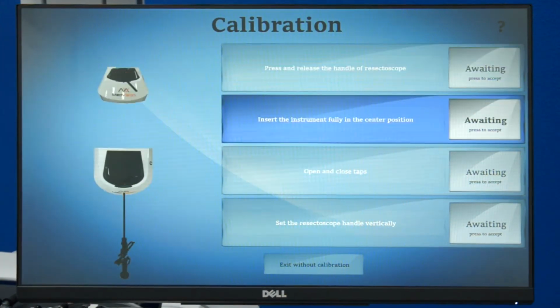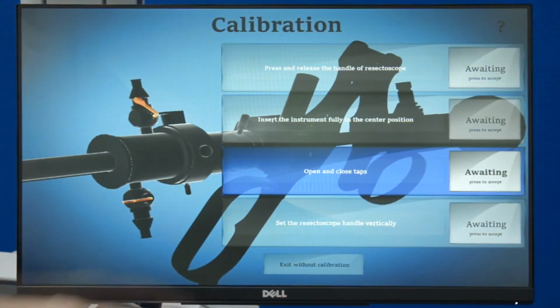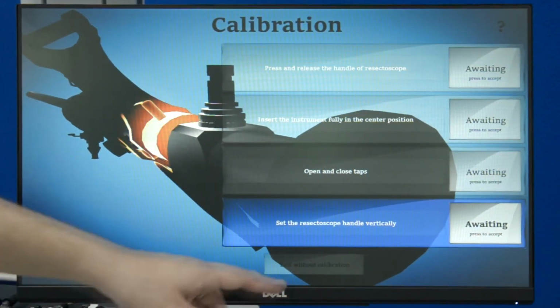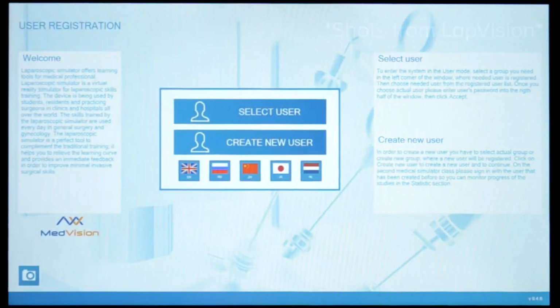And then switching to the next one is going to show you what you have to do. Next one, straightforward, self-explanatory. Same here. And here is where you exit. Done. Let's talk about service mode.